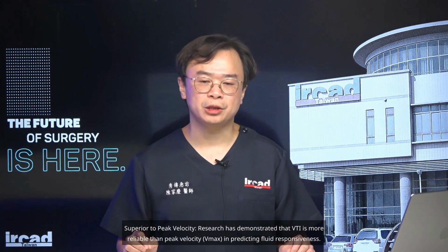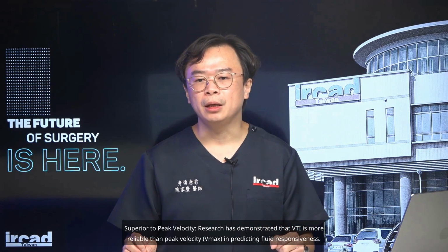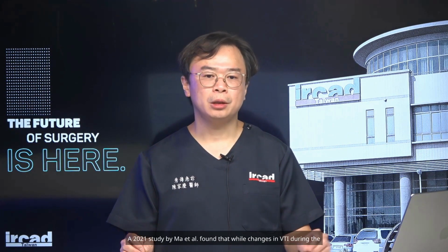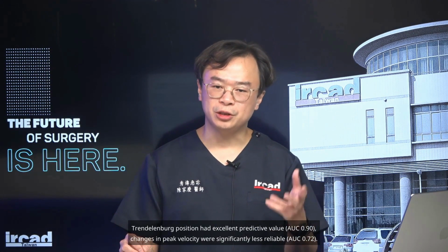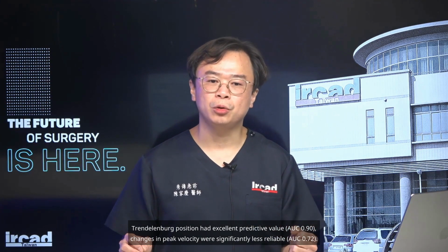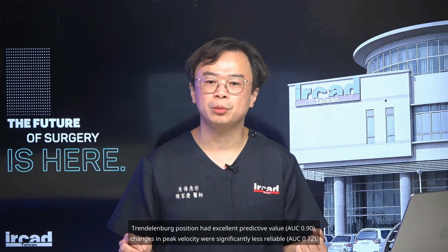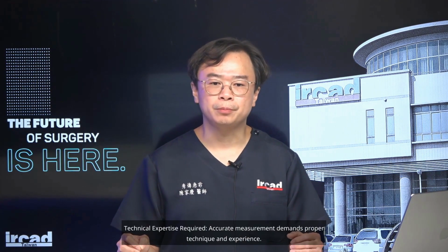6. Superior to peak velocity. Research has demonstrated that VTI is more reliable than peak velocity, Vmax, in predicting fluid responsiveness. A 2021 study by Ma et al. found that while changes in VTI during the Trendelenburg position had excellent predictive value, AUC 0.90, changes in peak velocity were significantly less reliable, AUC 0.72.